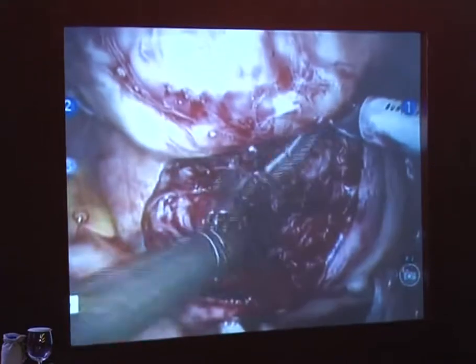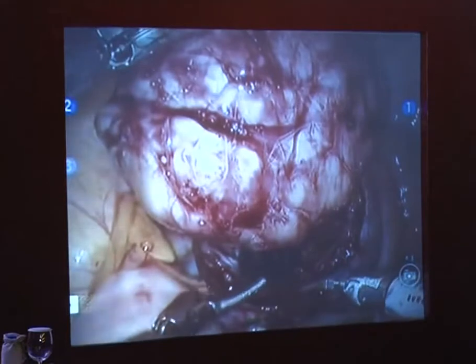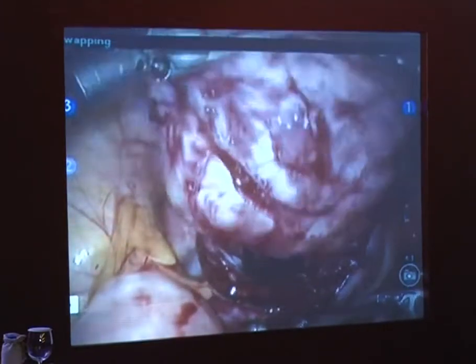Can I get the scissor changed out for the mega driver, please? I need the mega needle driver.